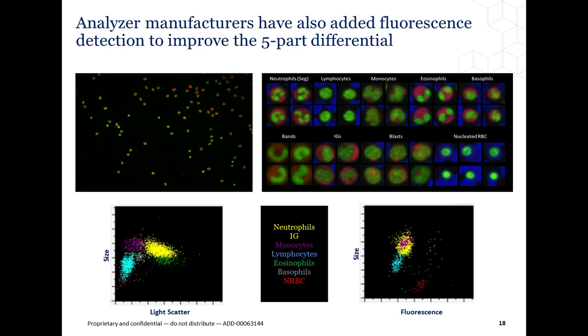As we touched upon fluorescence detection on the multi-channel example, this example of a single-channel fluorescent flow cytometric technology simultaneously measures and analyzes multiple physical characteristics of single cells as they flow in a fluid stream through a beam of light, in this case a laser. The cellular event properties measured include multiple angles of light scatter, as I said, not just 2, but multiple, which helps determine the cell size, granularity, internal complexity, lobularity, fluorescence intensity from the staining of nucleic acids in nucleated cells.